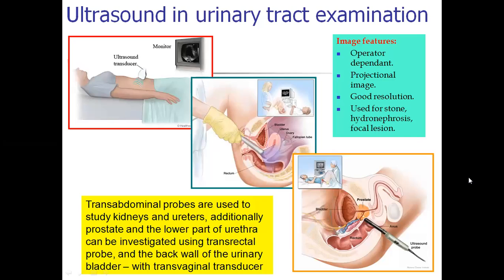There are two main techniques of ultrasound examination in the urinary tract.